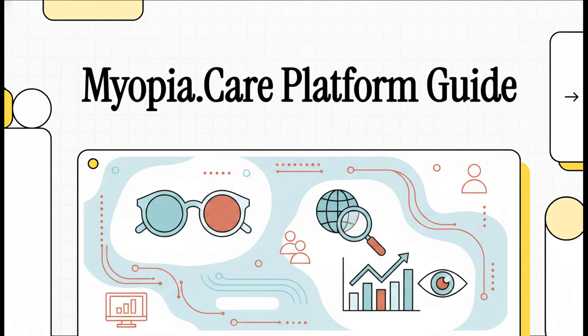Look, if you're actively managing myopia, you know how crucial it is to have a streamlined process. So today, we're unpacking a really effective tool for your practice, the Myopia Care Professional Platform. We're going to explore exactly how to seamlessly integrate this system into your daily clinical workflow, literally from the second a patient walks in the door to the moment they leave. Okay, let's dive into this.